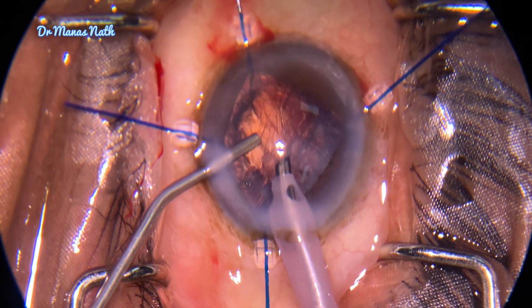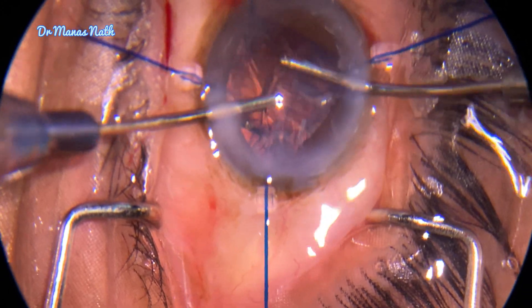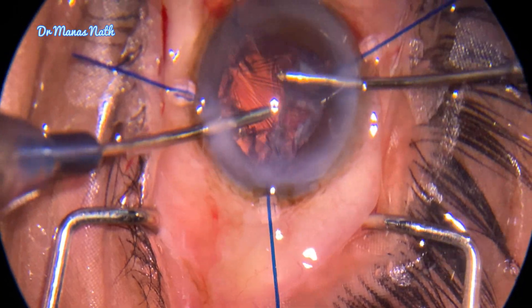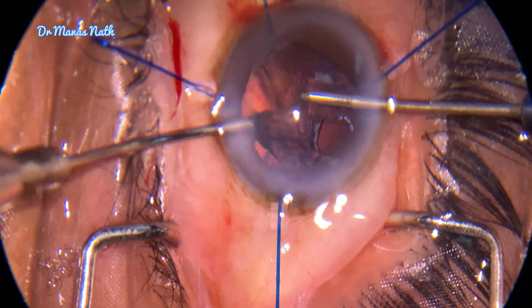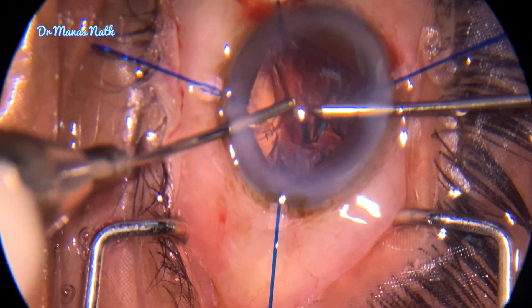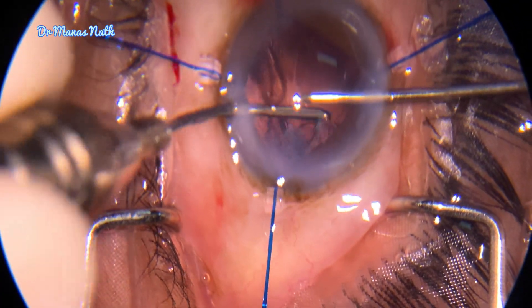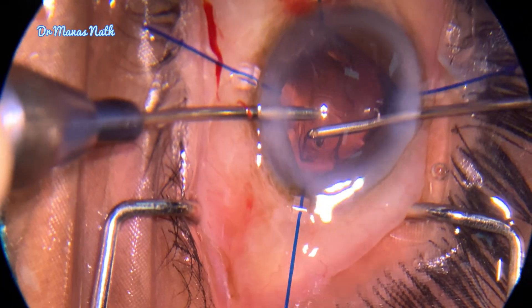Never allow the chamber to collapse; put viscoelastics while taking out. The main challenge now is to remove the cortex, as the cortex is trapped between the CTR which is inside the bag. With a tangential pull the cortex is coming out — one should not lose patience. Sometimes it takes time, but with the tangential movement you can see that it comes out easily.